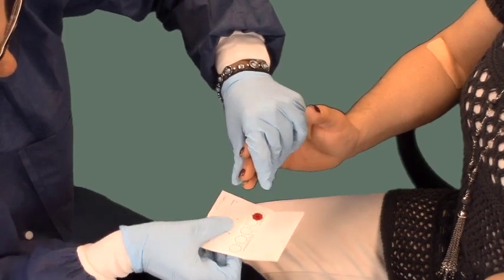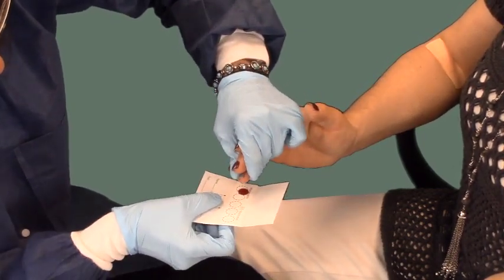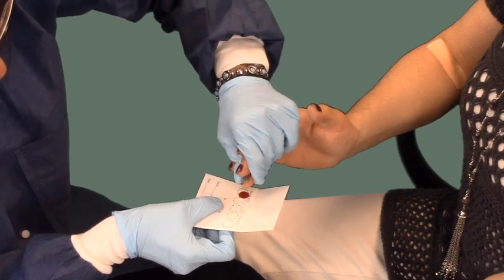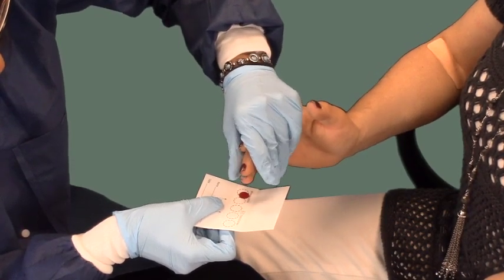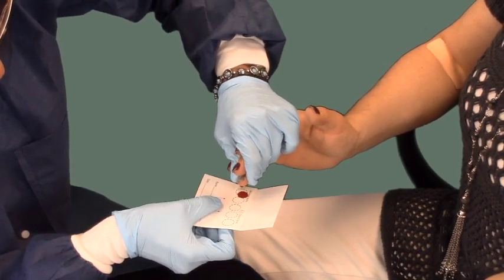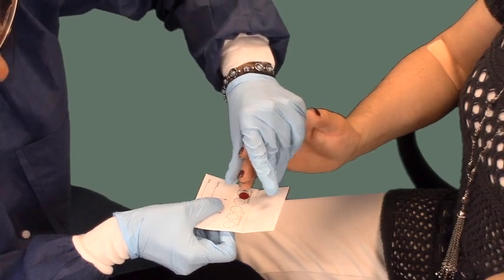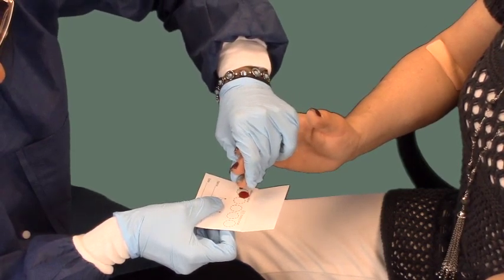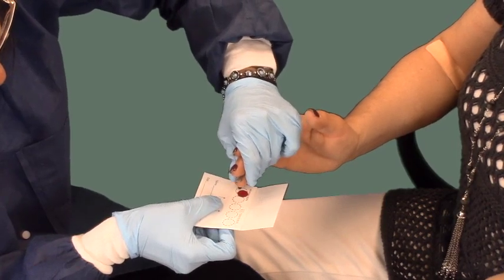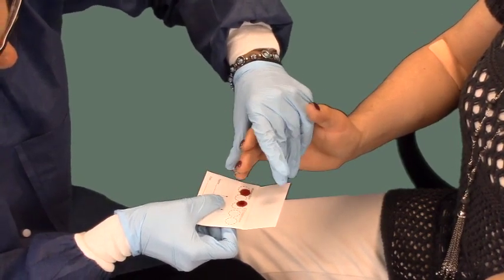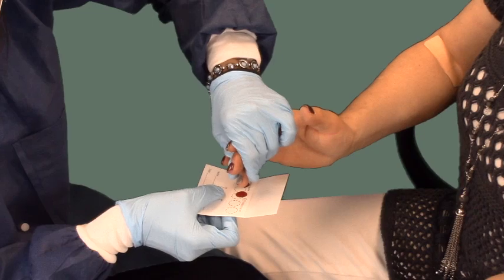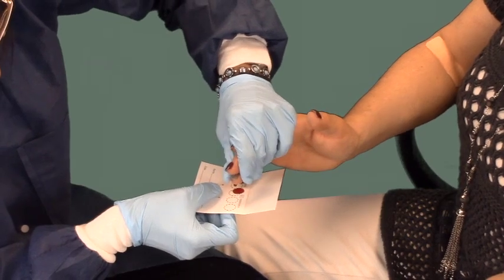Do not shake the blood drop to get it to fall from the fingertip. This is what standardizes the testing from one collector to another. It's a bit like target practice and takes patience for the blood to fall to the card. If you happen to miss the center of the circle on the card, skip the next circle and move to the following one. The minimum specimen volume for testing is two drops of blood.